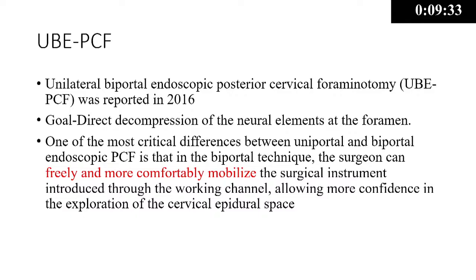So first of all, the journey started with the tubular retractors, then it went to uniportal. Now we are in the era of biportal. Biportal was started in 2016, and the goal was direct decompression of the neural elements. The main difference between the biportal and the uniportal system is that the surgeon can freely and more comfortably mobilize the surgical instruments.